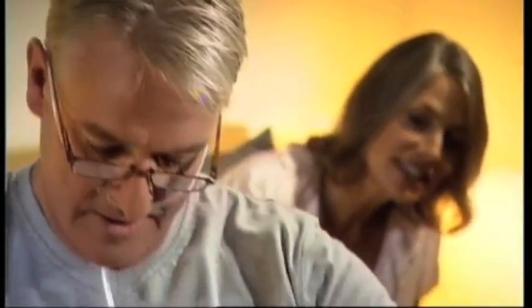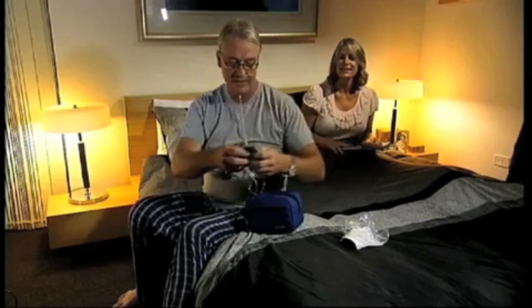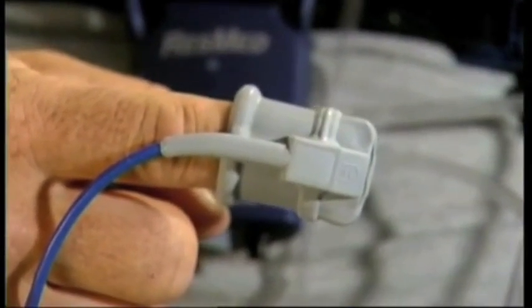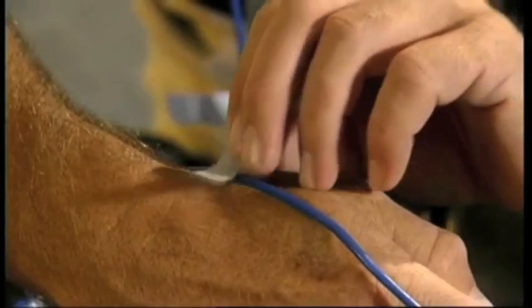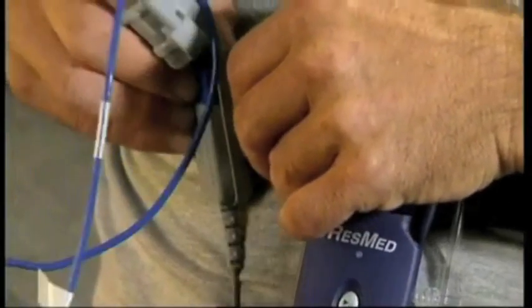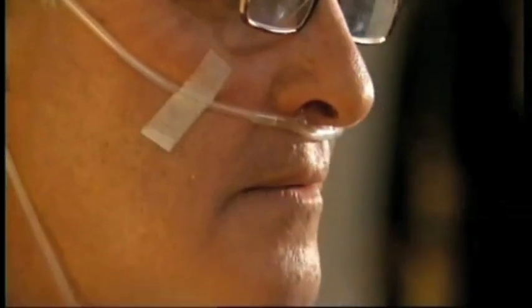Your healthcare provider may have already done this for you. The one remaining task is to attach the pulse oximeter device. Place the index finger of either hand in the sensor and secure the line using the tape supplied. If your healthcare provider has provided you with a different oximeter sensor, please follow their instructions. Now, you can attach the oximeter to the belt alongside the ApneaLink Plus recorder. If you're an active sleeper, you can also tape the nasal cannula tubes to your cheeks. The system is now fully assembled and ready to start recording.